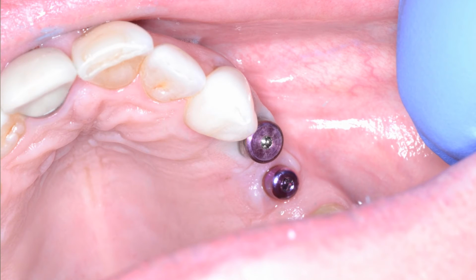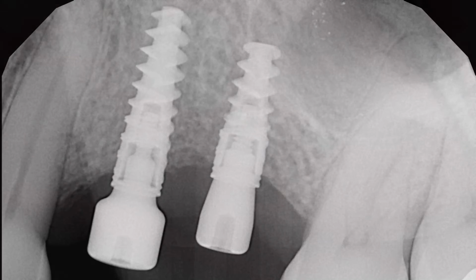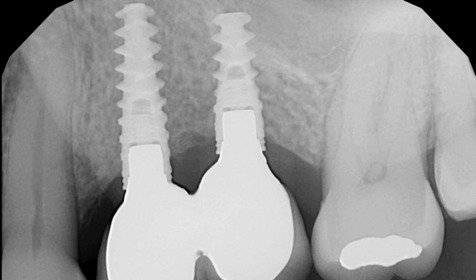Here's a photograph of some healing abutments that have been placed after the fixture level impression has been taken. Here's a radiograph of these healing abutments in place for the patient. When the patient comes back with the prosthesis, we take those healing abutments off and see how things are nicely healing around these implants with those conical seals. In this particular patient's case, we gave the patient 2 premolars fused together in order to get more stability and also to alleviate the bruxism habit that was reported.